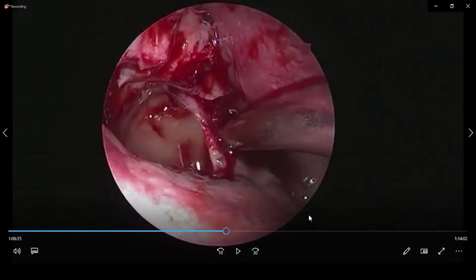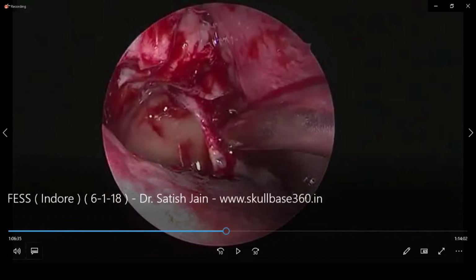So depending upon the need, depending upon the pathology, sometimes you deal with tumors and so many other indications like odontogenic cyst and other things, you can flush it for long-term surveillance. So in this case, it is not required anymore. So this middle meatal antrostomy dimension all depends upon the indication for what you are doing.